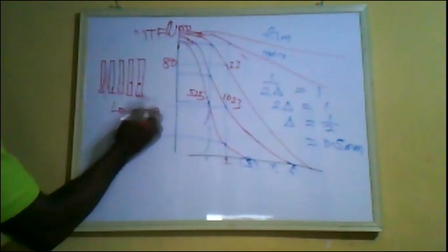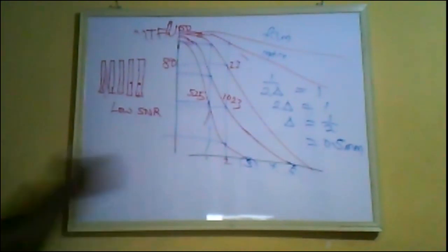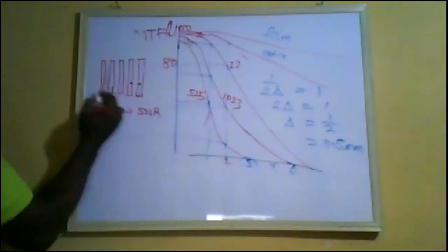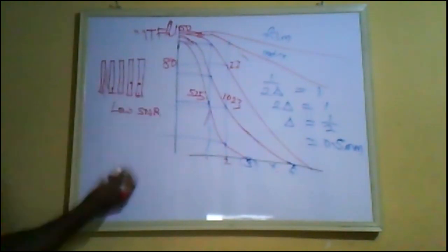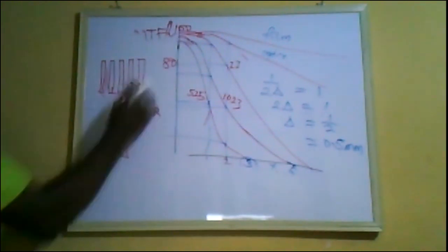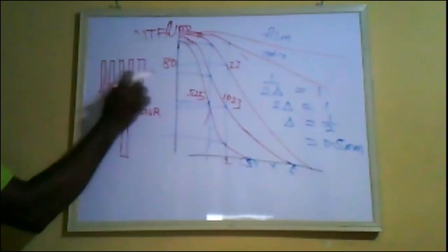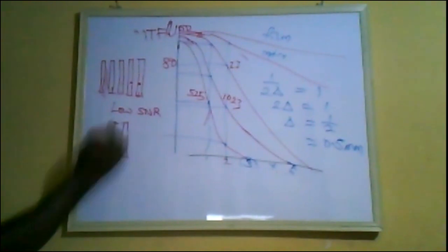You're going to have a low signal to noise ratio. Instead of that, if we want to improve this SNR, we can average these 5 frames: 1, 2, 3, 4, 5. When we now average them, the frame we get is just the average of everything. So some of these things here will also appear here. But initially, if we had used only this one frame, we would not have anything.